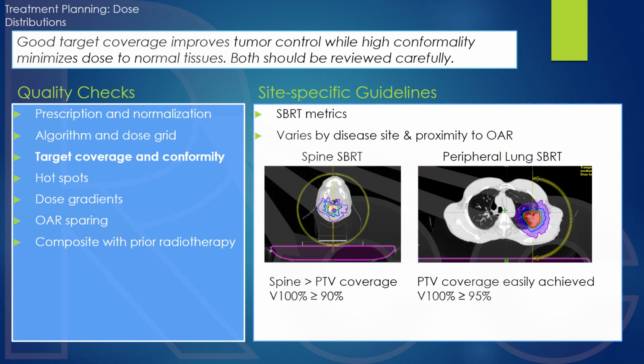What you should expect in terms of numbers or values for these metrics very much varies based on the disease site. It very much varies based on the metric that's being used. And we really don't have time to cover all those details right now, but I think we could save that for follow-up later. Okay, and yeah, I think you will cover gradient in upcoming slides. The question is about perfect gradient. What is the perfect gradient for SRS? And I will answer the modulation factor question in the chat. I will type that answer. Okay, thank you.